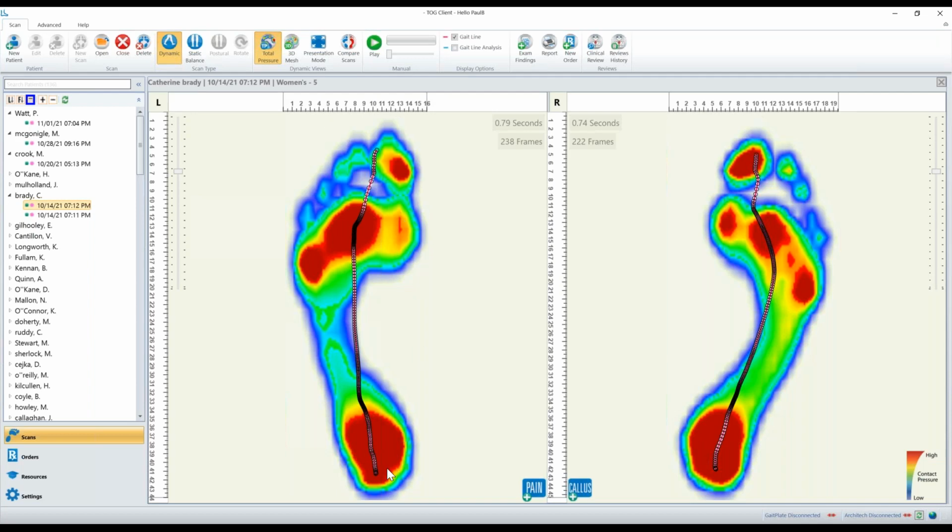When we used to make orthotics by hammering nails into bits of plaster, we would have put a nail in here and a nail here, and you would have had it from here to here, here down, and that's your sort of golden triangle, where you're getting a lot of stability if you've got a good sized triangle, because the area under that triangle gives you a lot of your stability. And if you imagine the line comes up and across from here to here, you're getting a good triangle, okay? You're getting a good amount of stability.